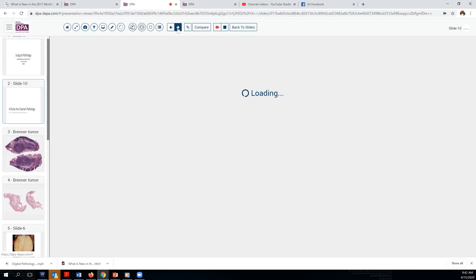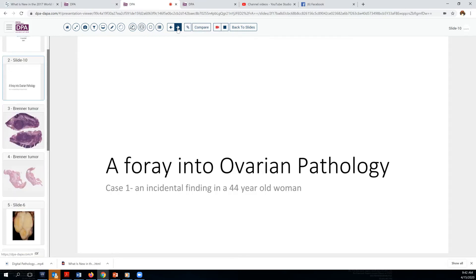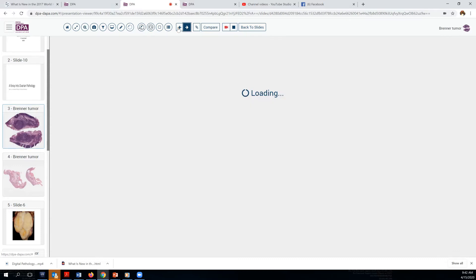For today, we're going to take a little foray into ovarian pathology, and our case is actually that of an incidental finding. A 44-year-old woman had an oophorectomy along with a hysterectomy for other causes, and on examination of the ovary, a small mass lesion was identified in the parenchyma.